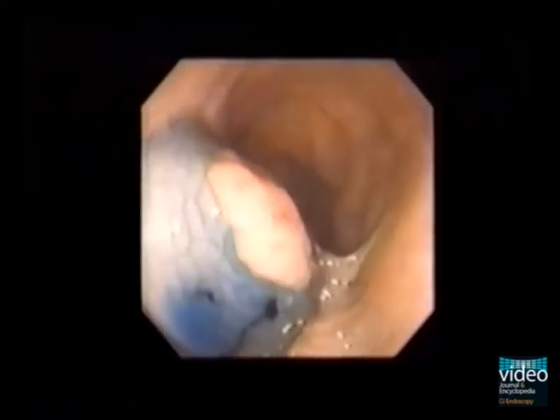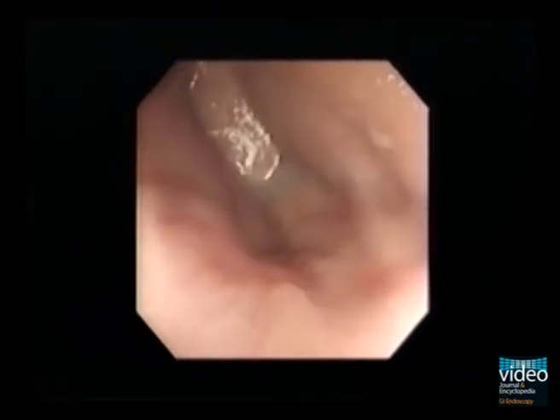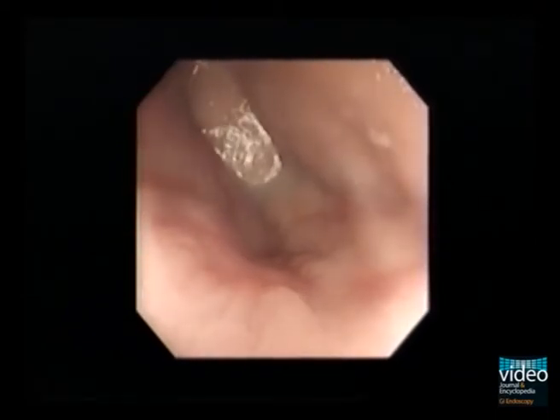Indeed, after resection, the specimen showed an invasion of the submucosa not deeper than 400 micrometers.